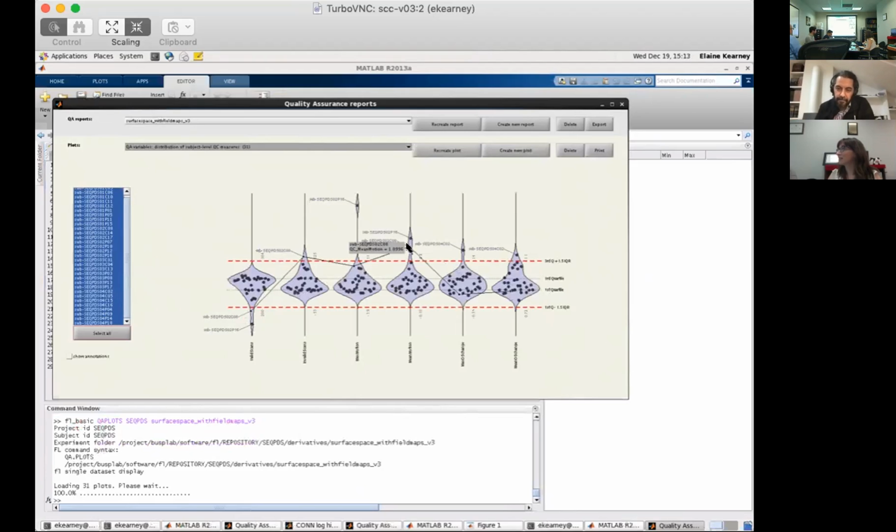I think those are all the questions that I had. Right, and the fact that you don't see that in the average means it doesn't show up as high values in the global signal. The two on the right show you the amount of change in the global signal from scan to scan. Typically when you see a lot of motion, you also see a lot of global signal changes because it creates some artifacts. But in these cases, it doesn't seem to correlate with high values. So that might give us some hope that perhaps it's not necessary to remove those subjects.